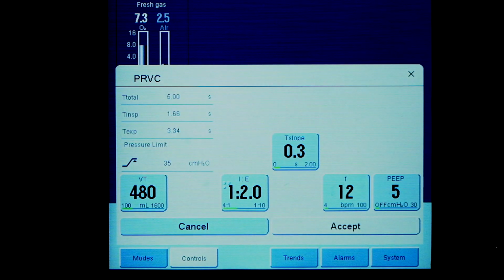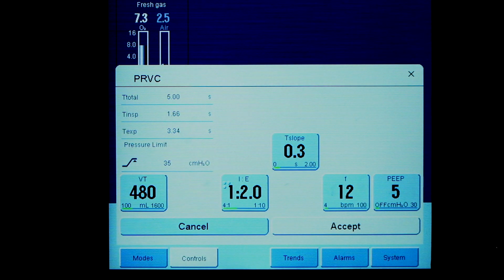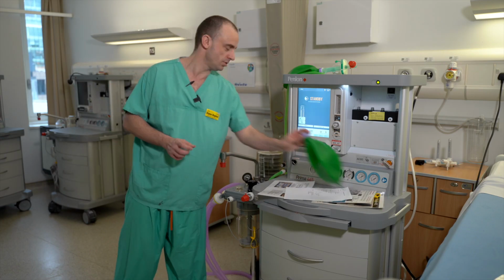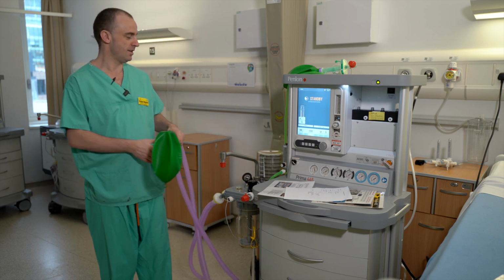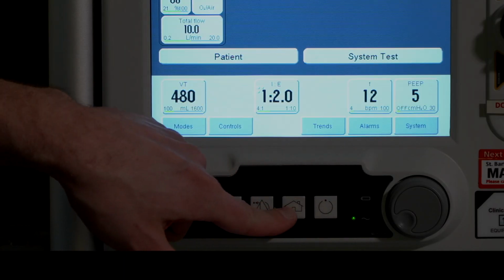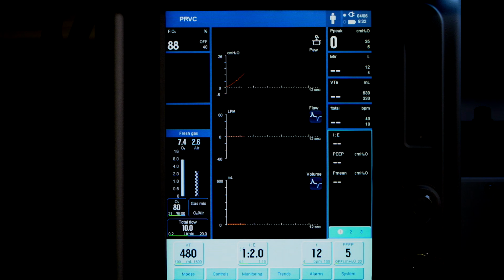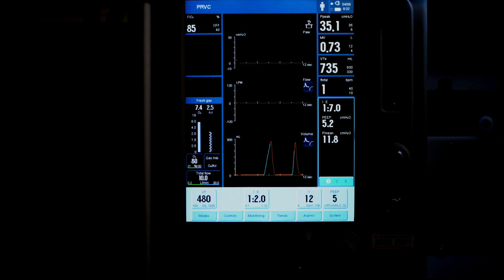PRVC, again, a familiar mode to many of us, and you can set tidal volume, respiratory rate, I to E ratio, and slope. Accept, and then whatever mode that you want to do, you start the ventilator by pressing this button here. So this both starts the ventilator and stops. It takes a little moment for the ventilator to start working. It's slightly longer than the Maquet machines that we may be familiar with.